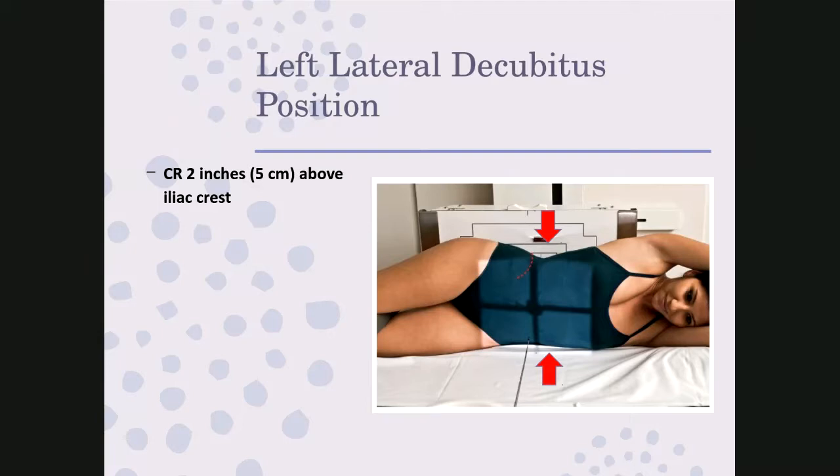But what I'm telling you with these views that we've talked about so far, your first image would be up top so that you included the diaphragm, and then your second image would be at the bottom. So if we try and draw this out, and I use something other than red, you would start by doing one crosswise IR to include the top.